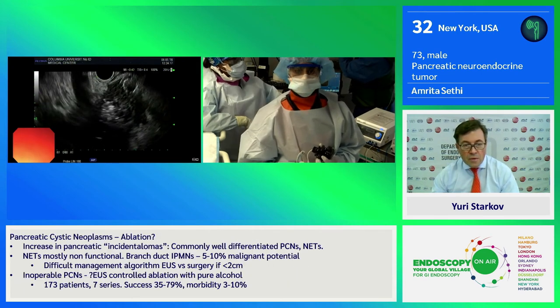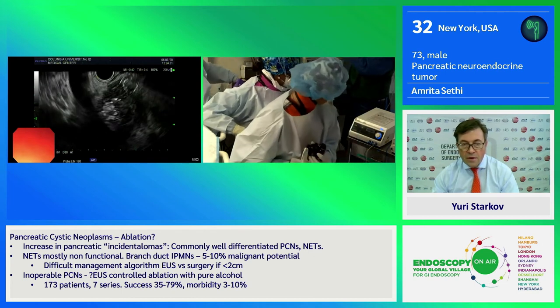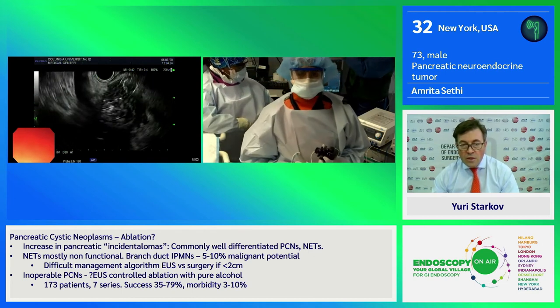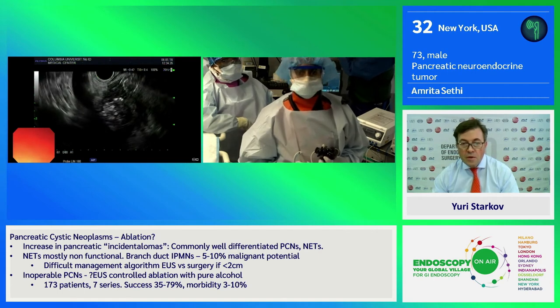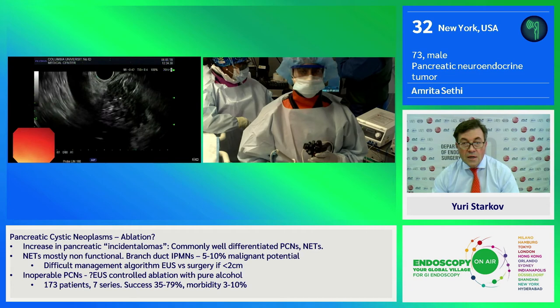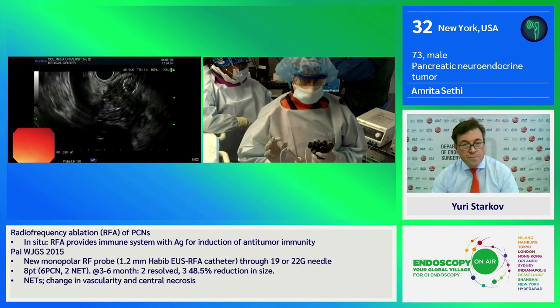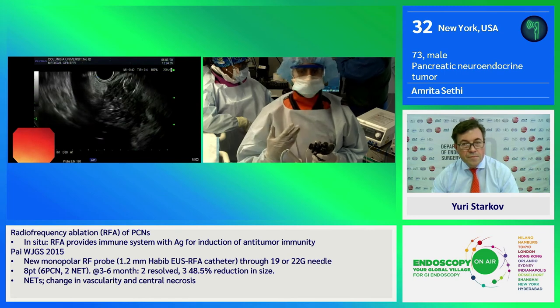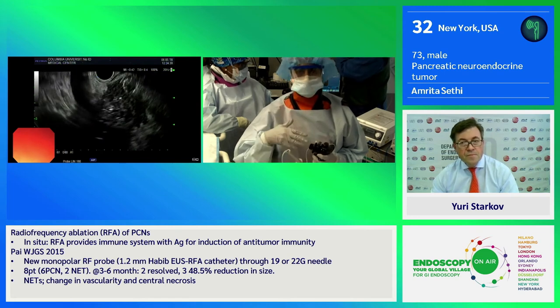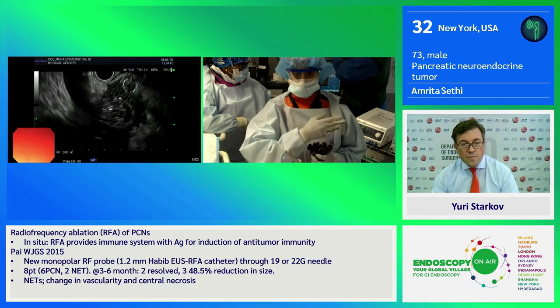Can you tell me how to determine the completeness of tumor treatment? When do we need to stop the procedure? So we just stopped. I stopped because we reached about 30 seconds. It does have an automatic cut-off, but if that does not turn off, it means the impedance has not been reached. So I just turned it off because we reached our time limit.